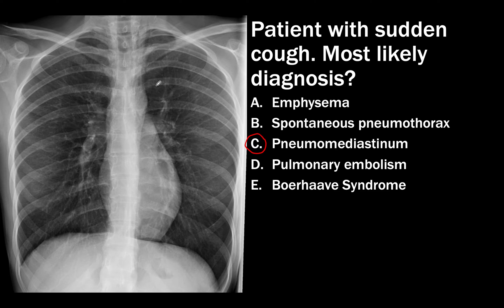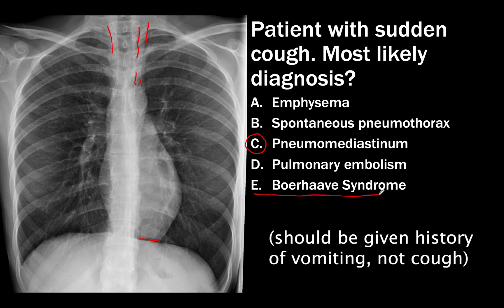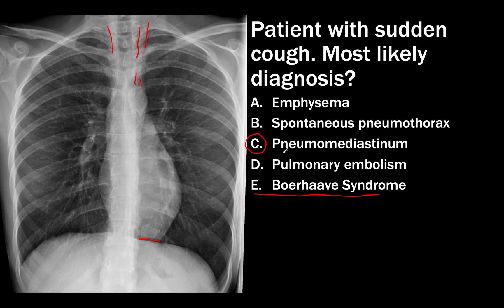The abnormality that we see here is hyperlucency, or lucent lines, in the superior aspect of the mediastinum, as well as hyperlucency along the left hemidiaphragm. These are all signs of pneumomediastinum. It's possible that the patient could have Boerhaave syndrome, but pneumomediastinum is the more specific and correct answer.